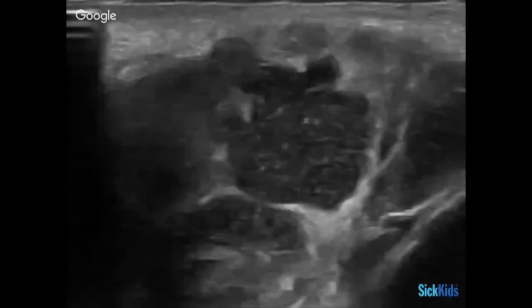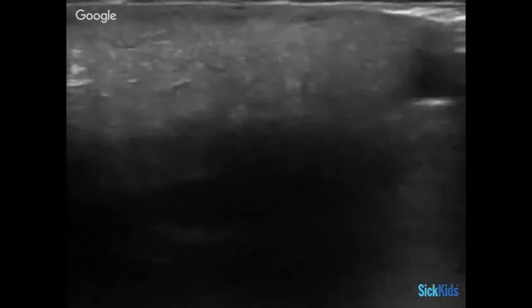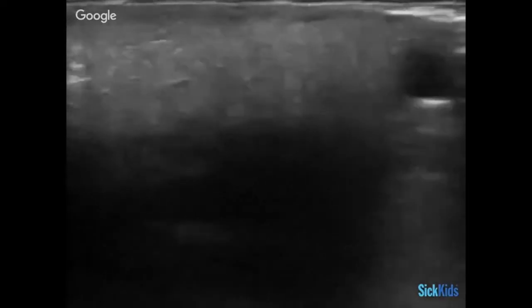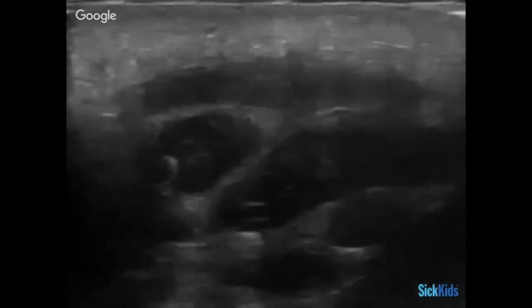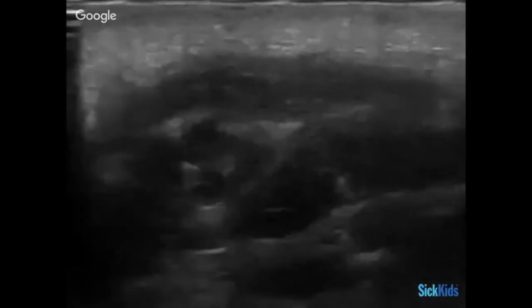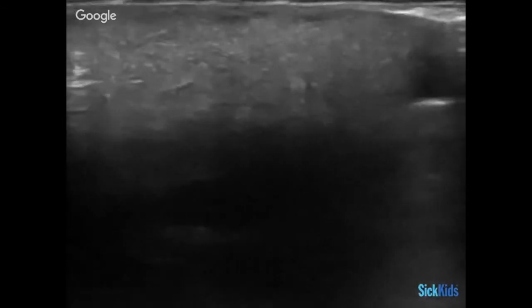And you think this is tuberculosis? No. All you can tell is what you see. This is where it's important to have the context of the case you're seeing. If you were in an area that was endemic for tuberculosis, if the time frame fit, potentially. Scrofula can also go through a series of spectrums that can mimic. I don't pretend to be an expert because we don't see a lot of it here, but my understanding is it can go through a similar kind of spectrum.